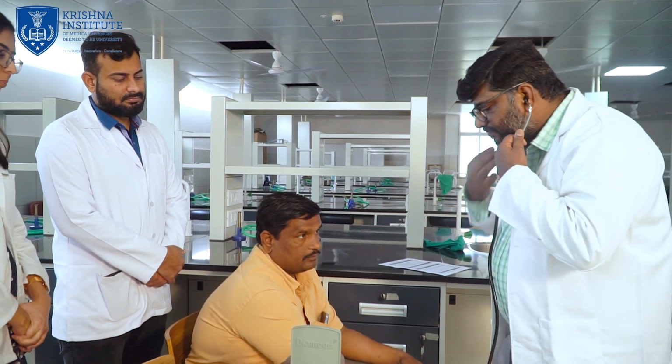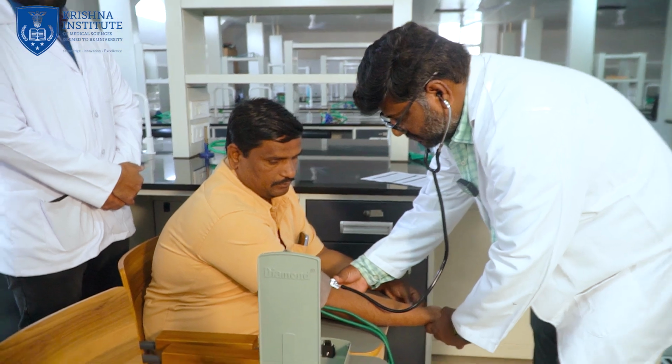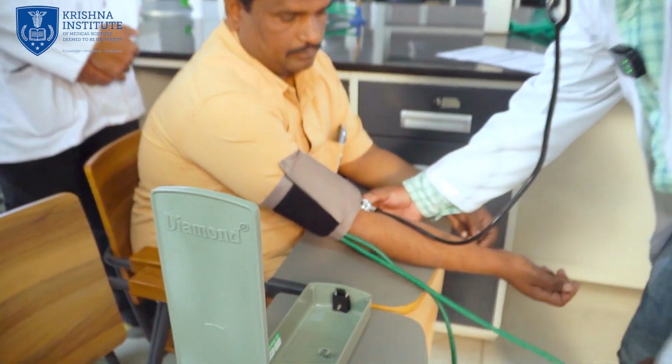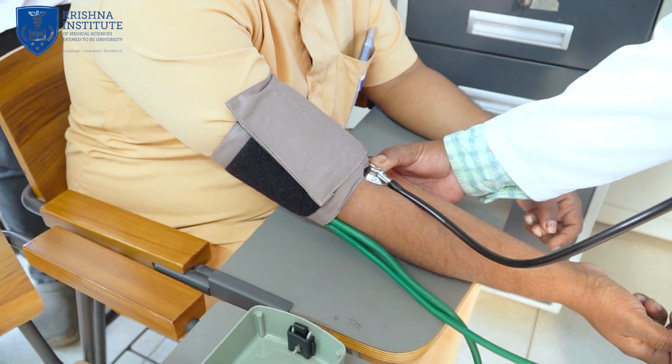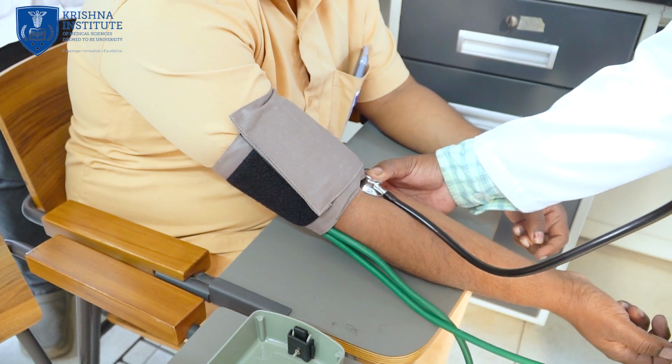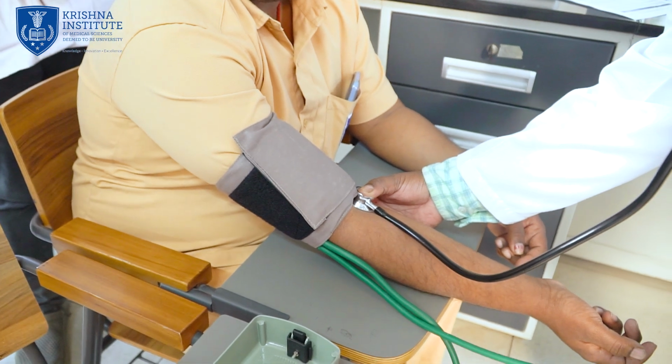You're supposed to keep the stethoscope on the brachial artery and slowly deflate the cuff. Note the first Korotkoff sound.